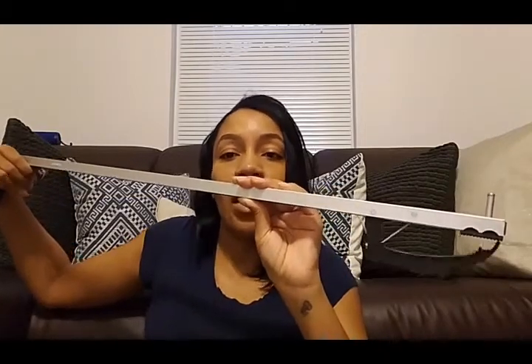All right. Yeah, so it's a reach or a grabber. Basically, if I drop something on the floor, or I have to pick something up off the floor, this is what I would use. Now, this doesn't pick up anything big and bulky. It will pick up just small, light things like a paper on the floor, a sock, or clothes. It can't pick up a big bottle or anything like that. Just pretty much light things.